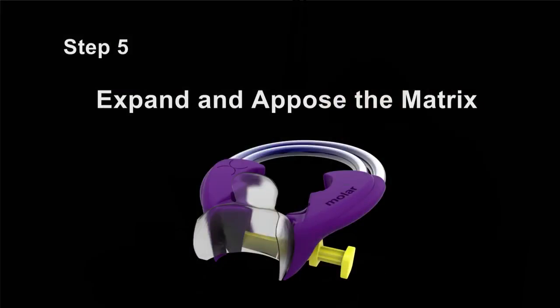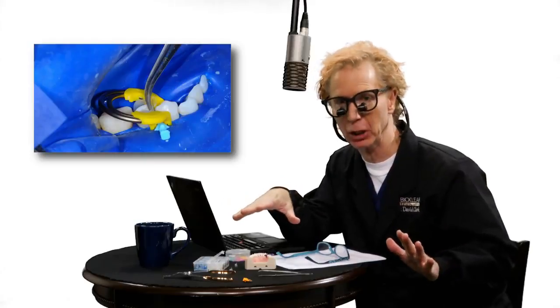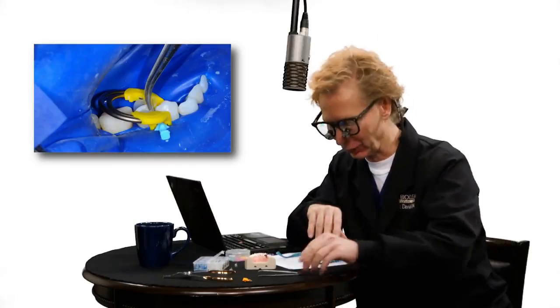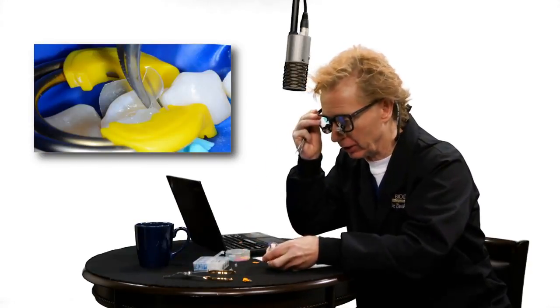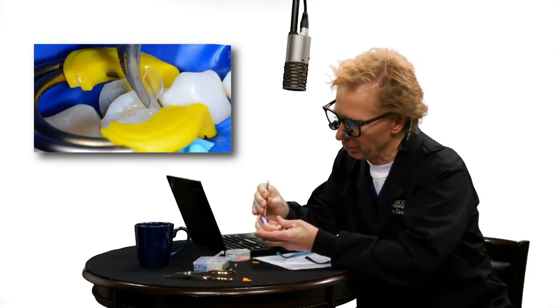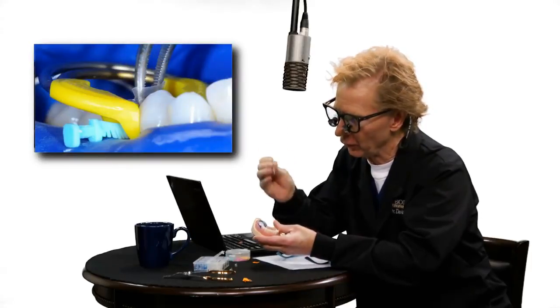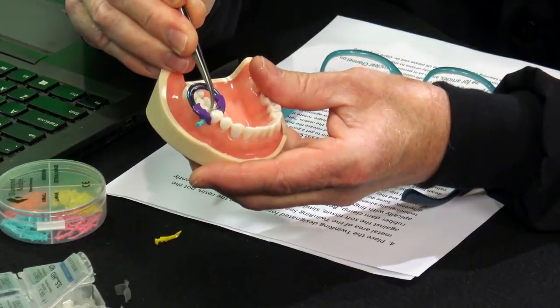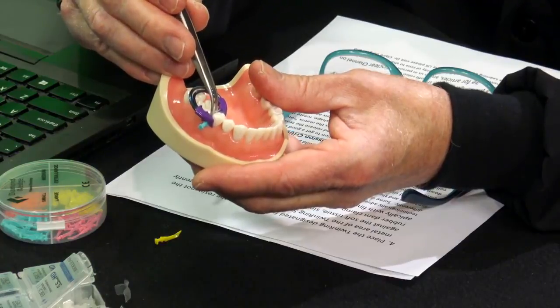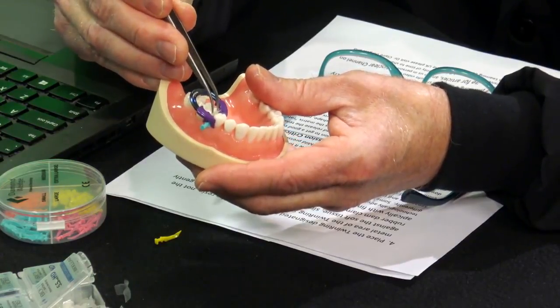Step five: expand and appose the matrix. This replaces old-fashioned techniques like burnishing — burnishing has got to go away. Use the micro pliers that come with the system to expand the matrix buccalingually. Insert the cotton pliers closed into the cavity preparation, then let go and let them expand, widening the contact buccalingually as wide as you can.